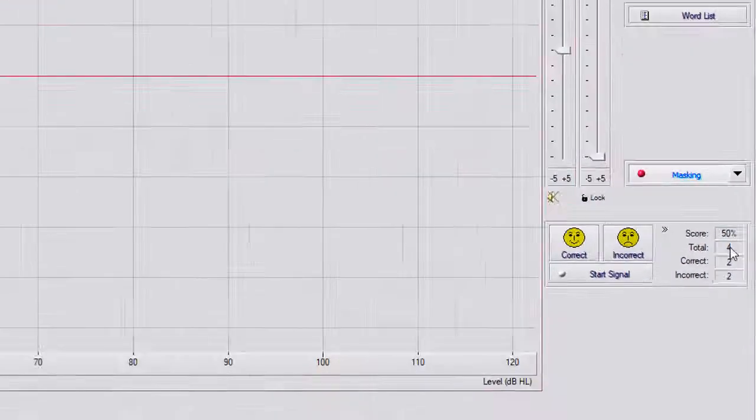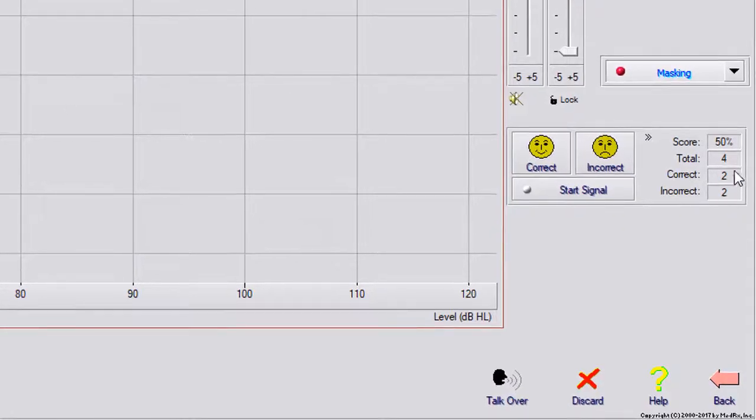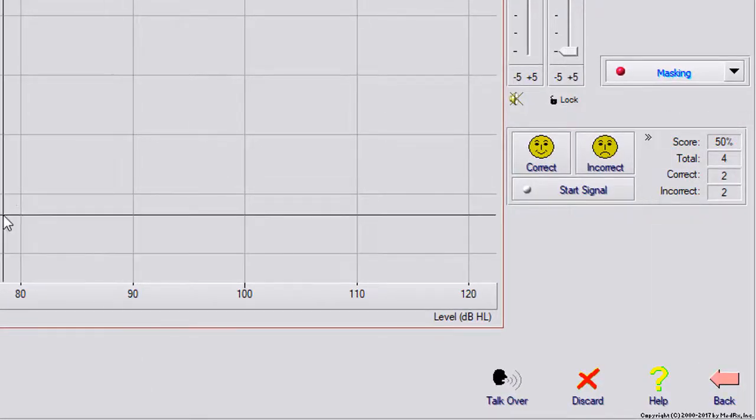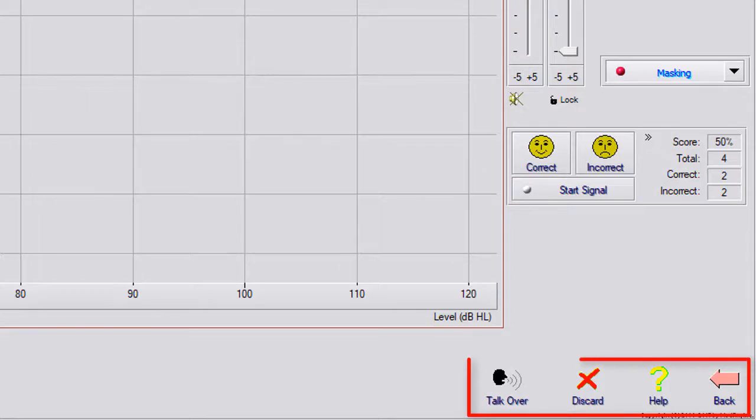You have your scoring, 50%, four total words, two correct, two incorrect, and then all of your controls at the bottom are the same.